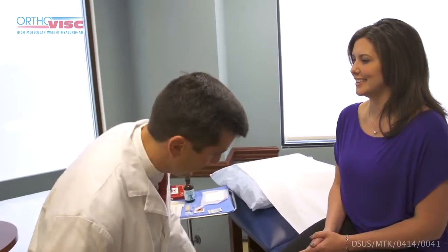Hello, how are you today? Excellent. What I'm going to do is go through the injection procedure with you today. If you have any questions or concerns, please don't hesitate to ask me. If you need me to stop, that's fine — just let me know. I'll go through each step with you, and at any point you're welcome to ask me any questions regarding the procedure itself.